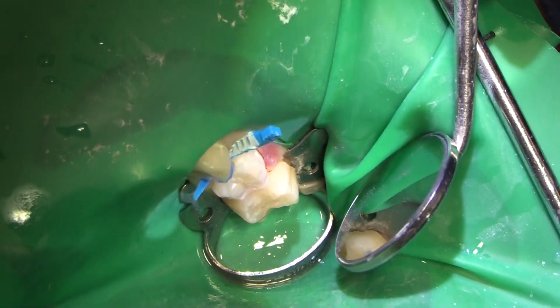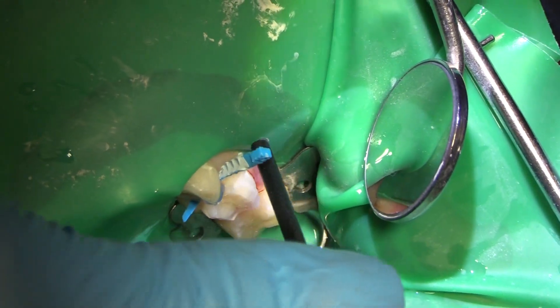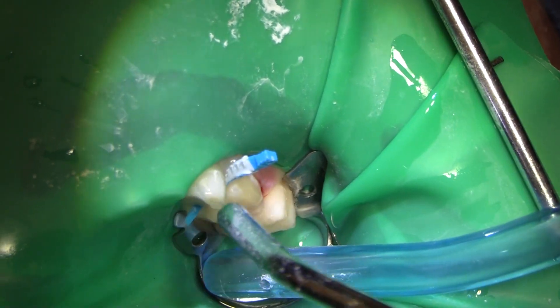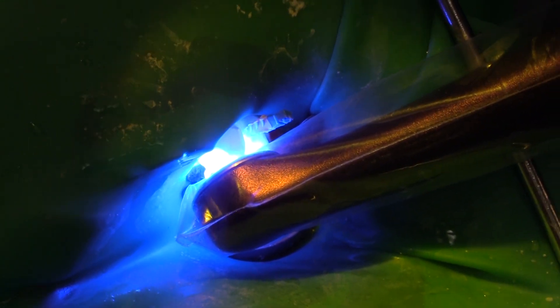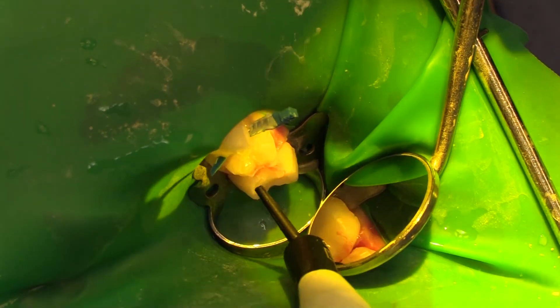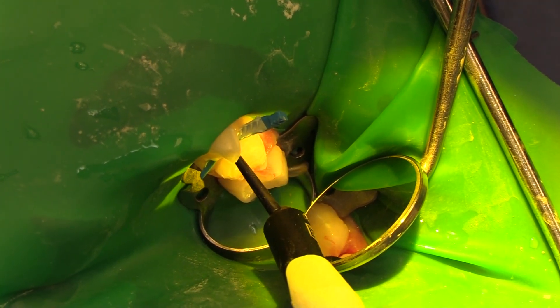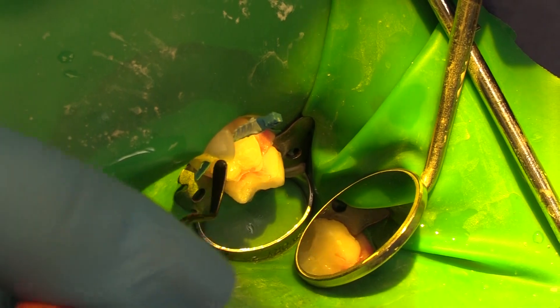We're going to etch and put a little bit of flowable into the distal where the caries was on that cuspid, then fill that. You can see that decalcification on the buccal of that first primary molar — that's another indication for a crown there rather than doing a big composite restoration. Curing our bond on the distal of that cuspid with just a little bit of flowable. Not worried about bonding to the molar since I'm going to be slicing the mesial to place our crown. Flow is in; we'll cure that.